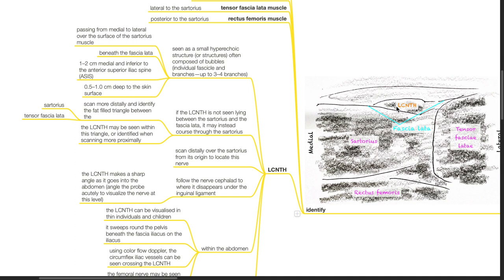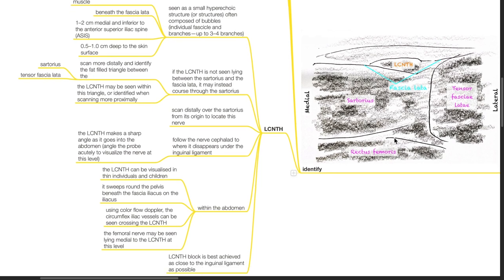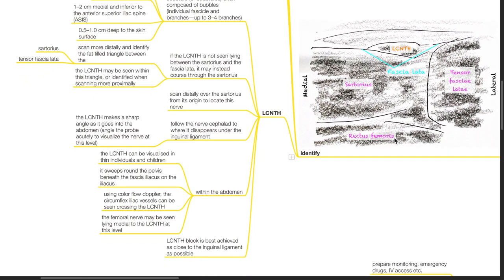If this nerve is not seen lying between the sartorius and the fascia lata, it may instead course through the sartorius. Scan more distally and identify the fat-filled triangle between the sartorius and tensor fascia lata. This nerve may be seen within this triangle or identified when scanning more proximally. Scan distally over the sartorius from its origin to locate this nerve.